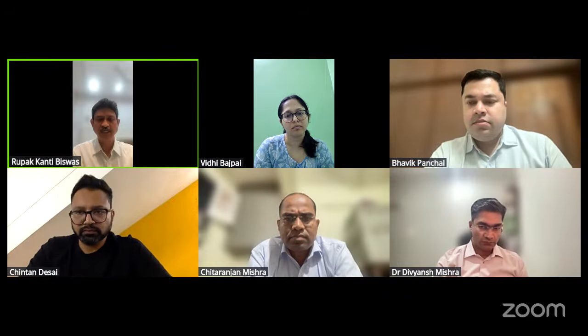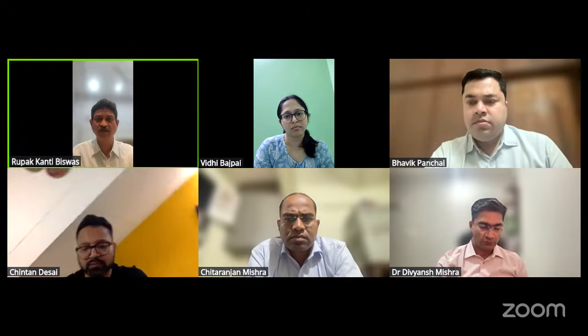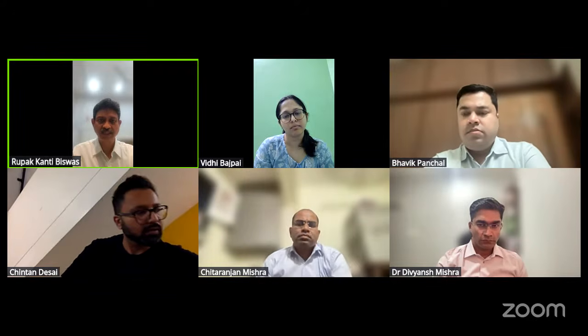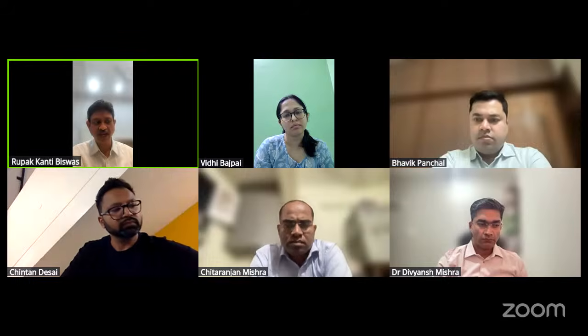Yeah, I think I will echo what Divansh was telling. See, most importantly, you need to cover the macular hole. It has been proved that for a larger macular hole, in the Western world they take more than 400 microns as a large macular hole. But for us, probably 600 or more. But anything beyond 400 or 600, we should plan for the inverted flap. Now, this inverted flap has different techniques, as both of them have shown in different ways.